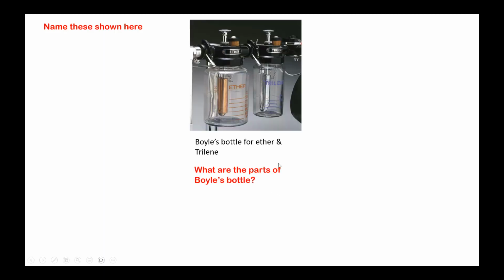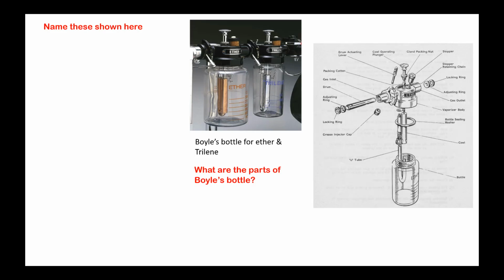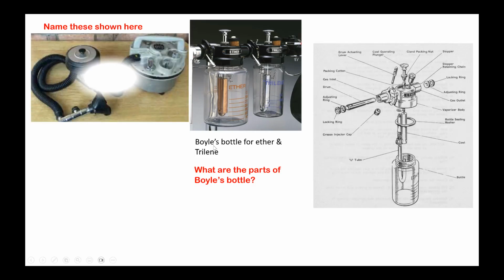These are all the bottles which we have already seen. This is the ether bottle with its markings. This is the lever to switch it open or close. This is the plunger to increase the vapor concentration. Here there is no specific concentration which can be measured. It is the lever position you can see in first position, second, third. There is no percentage. So they are all very unprecise, or imprecise, bottles. There is no temperature compensation.